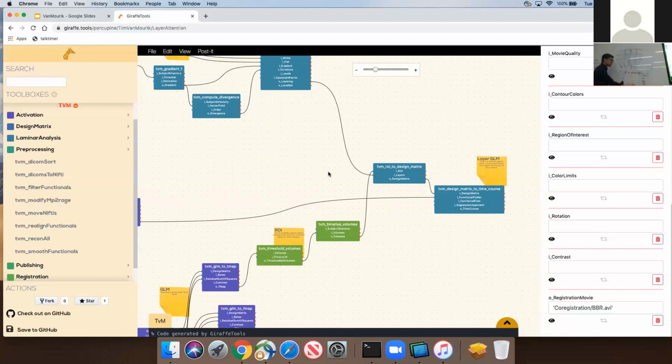These columns of your design matrix will be very collinear. And as soon as you've got collinearities, the inversion of the model doesn't really know to which bin the signal should be attributed. That depends basically on the orientation of the cortex relative to the grid size.